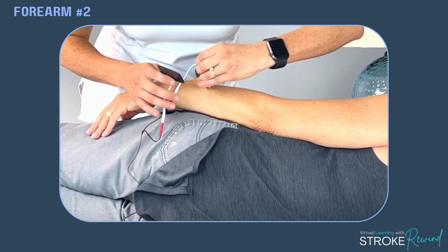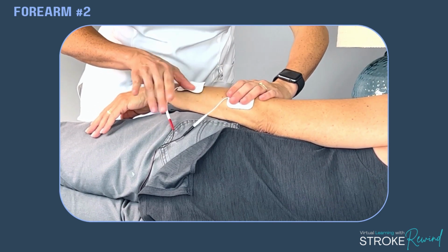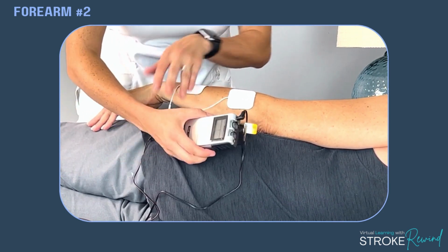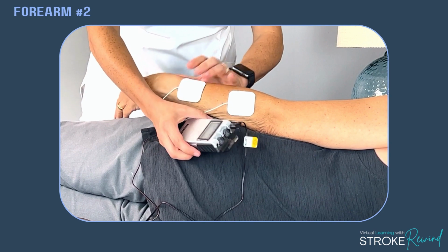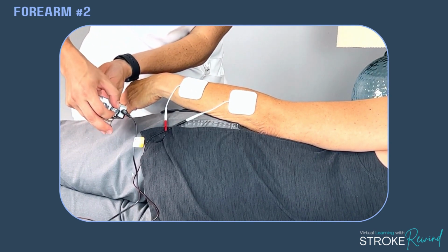I like to do black over red. Okay. You're going to find a placement and you're going to try it out. So same thing. You're just going to say, okay, I'm turning the machine on. Let me know when you can feel it.